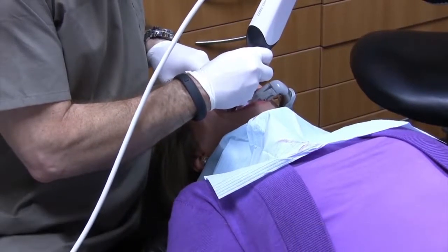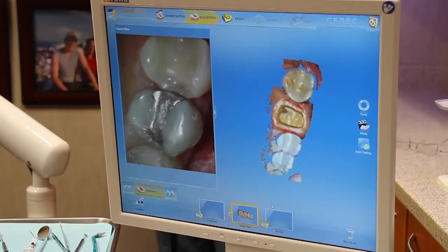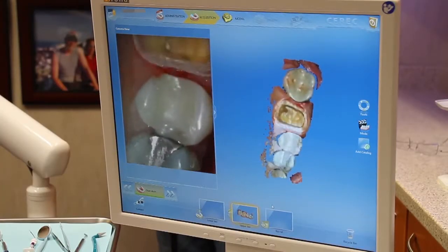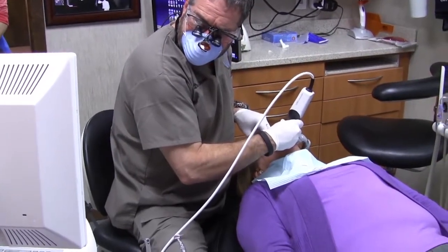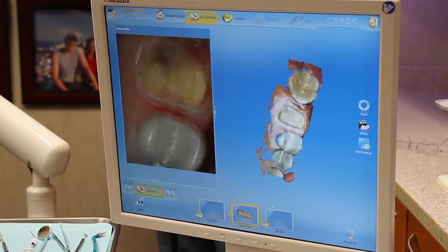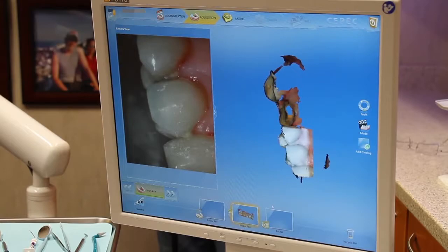After the preparation has been completed, we then take a digital impression with the CEREC Omnicam, which is a high-resolution video impression system. The arch with the preparation, the opposing arch, and the bite are all imaged to be used in the creation of the crown.